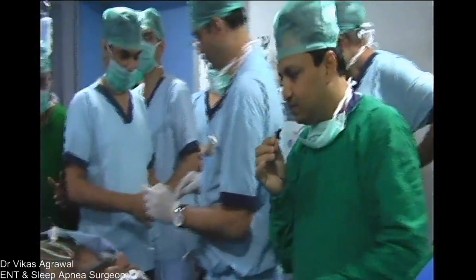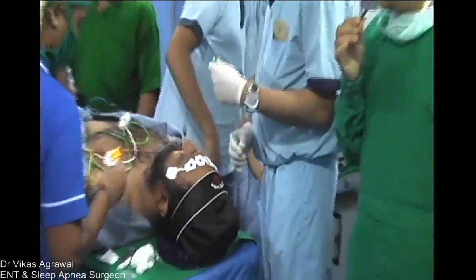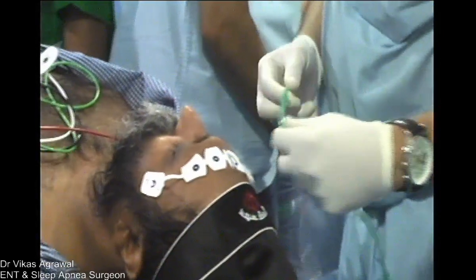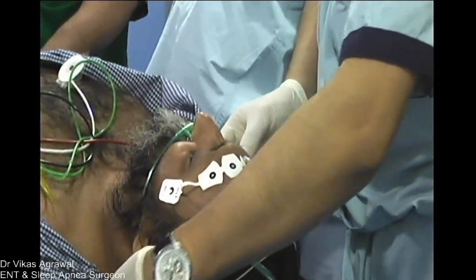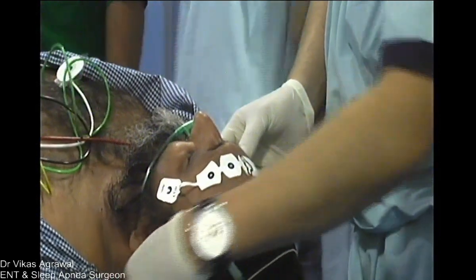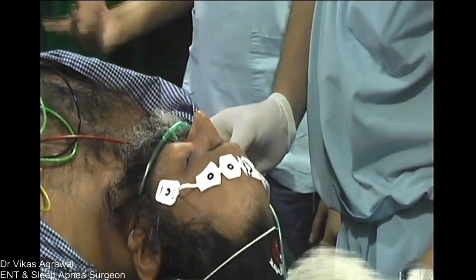So looking at his profile, nobody can say that he'll be a difficult intubation. But only on DISE, drug-induced sleep endoscopy, do we know what difficulties we are going to face. And if we are prepared for those difficulties, we will not face any difficulty at all.